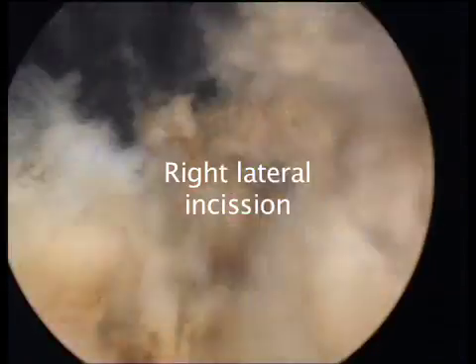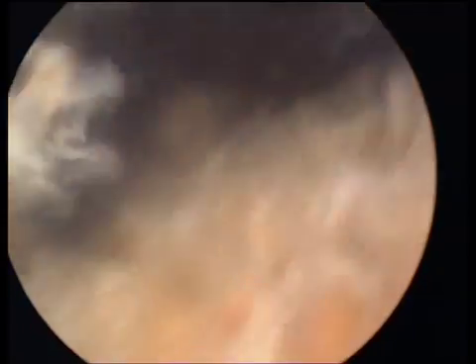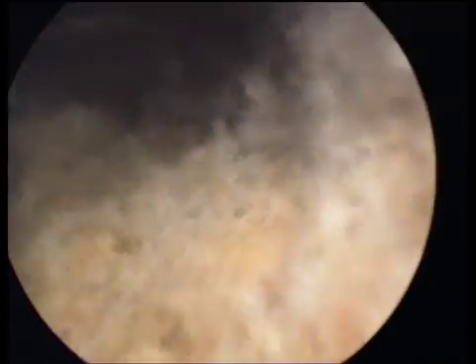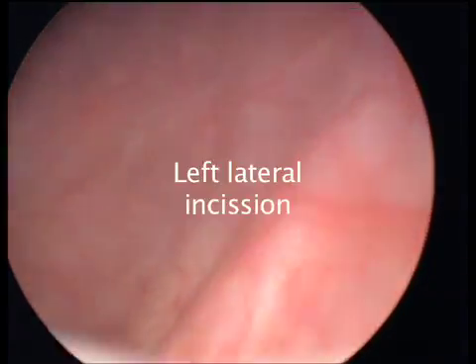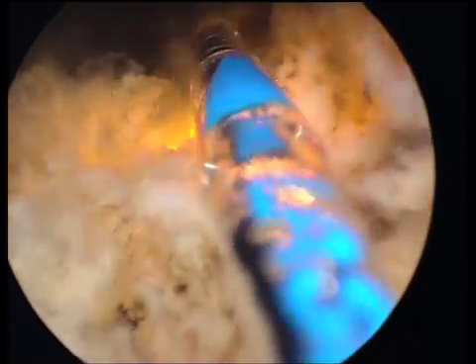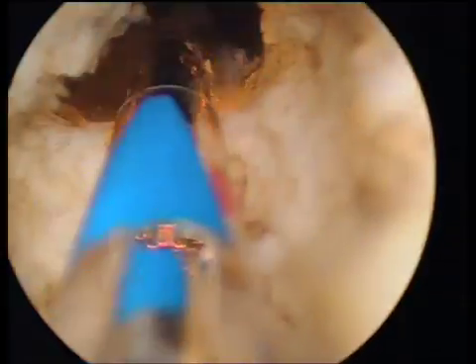That is the ureteral orifice on the right side. I like to perform a deep incision that will tell me how far or how deep I have to go. I do this usually on both sides — this would be the second incision on the left side. Then I perform a third incision in the midline because this one is very safe to perform.